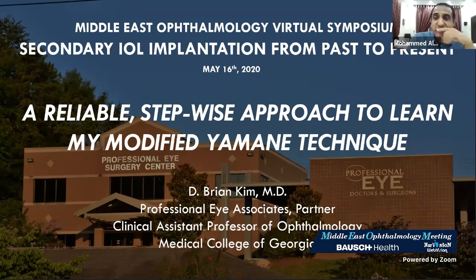Okay, there is a comment: the 2 millimeter tunnel is made blindly through the sclera. Depending on experience, how deep are you going to be in the tunnel?